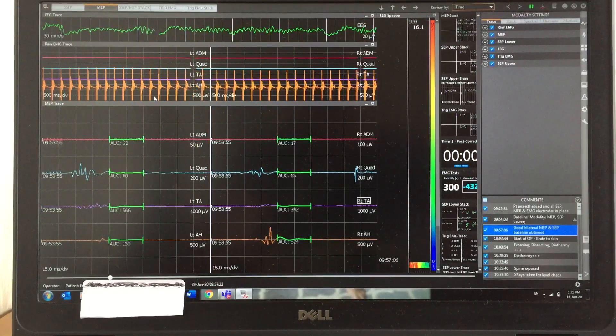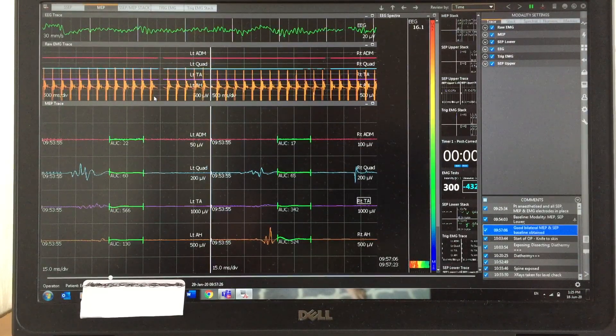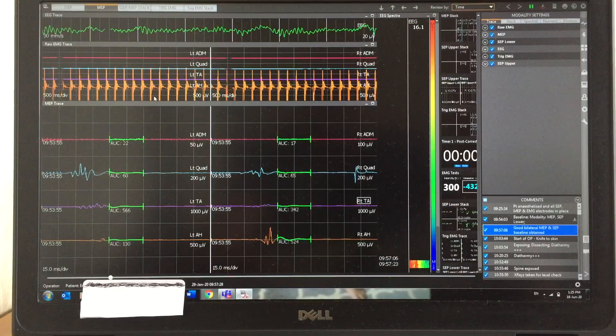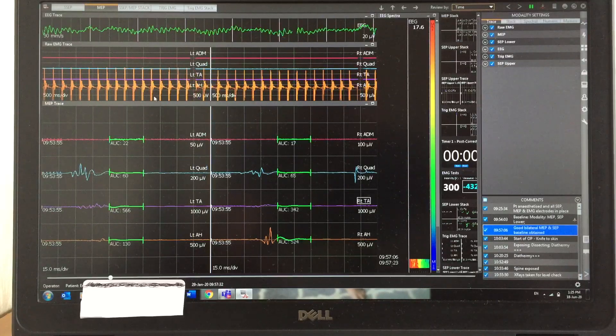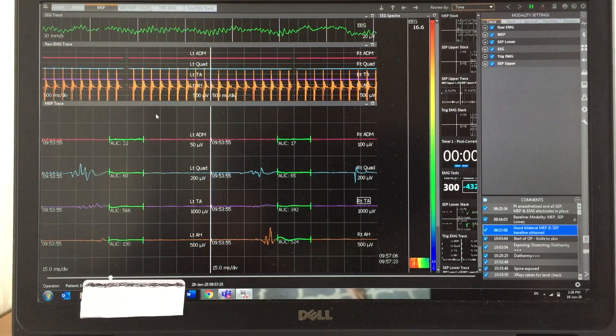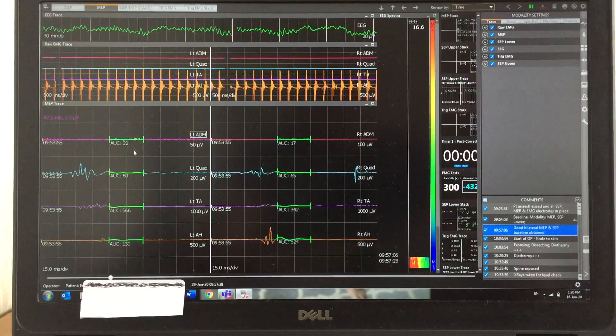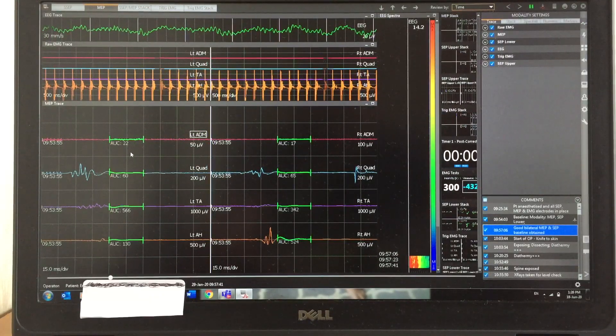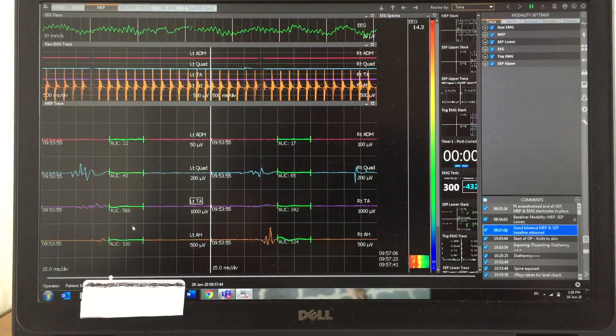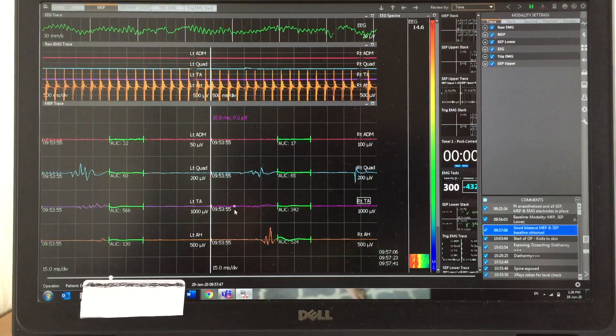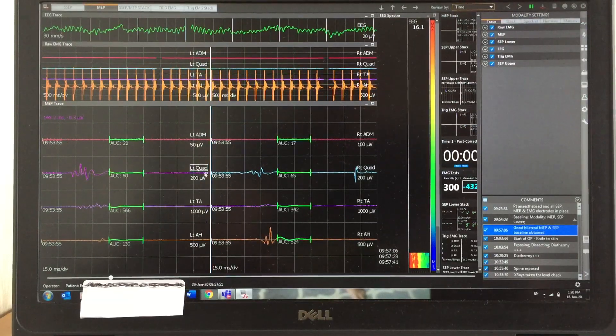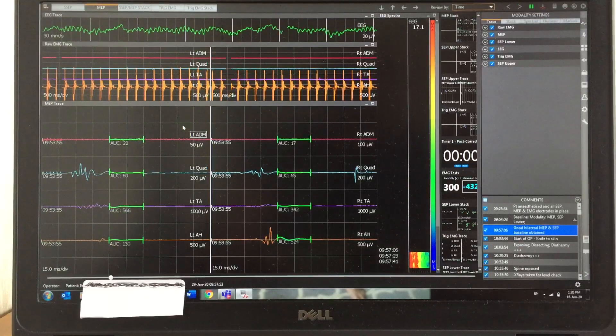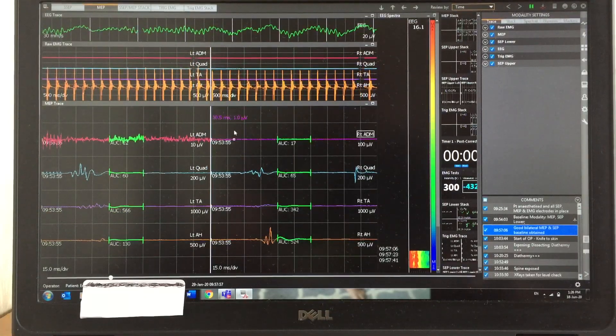This is a stimulus artifact because I'm stimulating the posterior tibial nerve. That's why you can see a lot of stimulus artifact over abductor hallucis. Here you can see the MEP responses—some are tiny, some are okay.